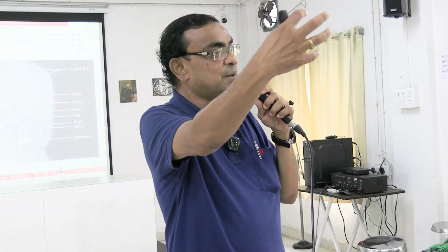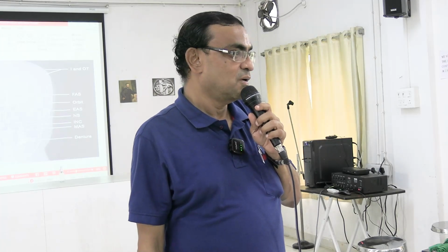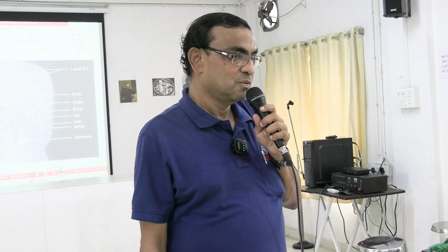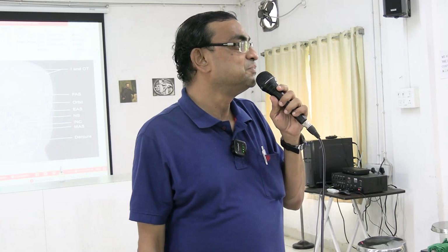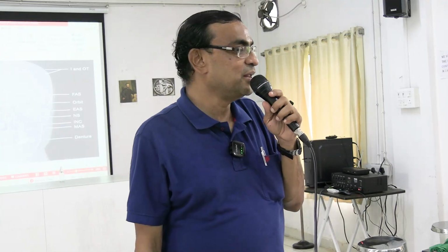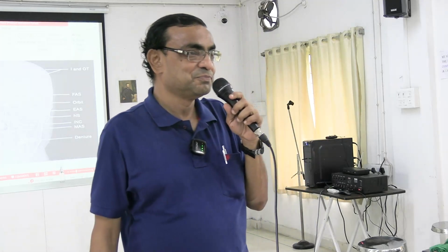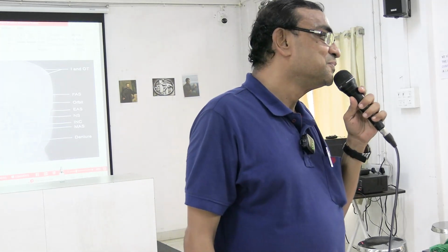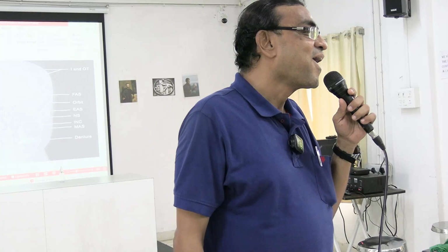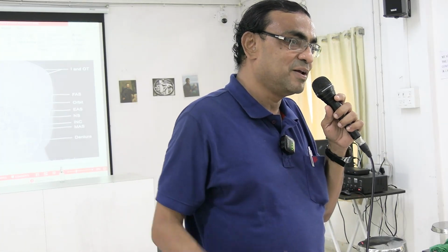If the light source is coming from the front, we can get the image, but where is the fallacy? Where is the problem? Can anybody tell me? Using your common sense. Very common. Just use your common sense. Why not the AP view?